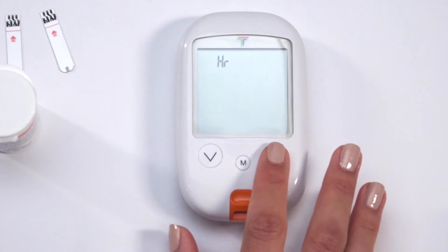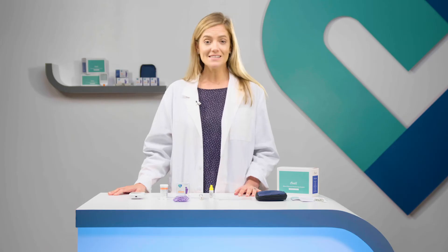First, choose either a 12-hour or 24-hour clock by using the arrow buttons. Press M to confirm. Adjust and confirm the following settings in the same manner.